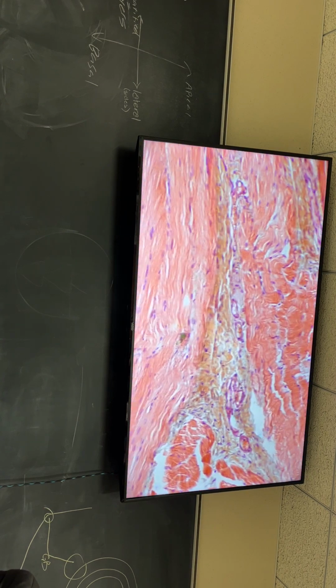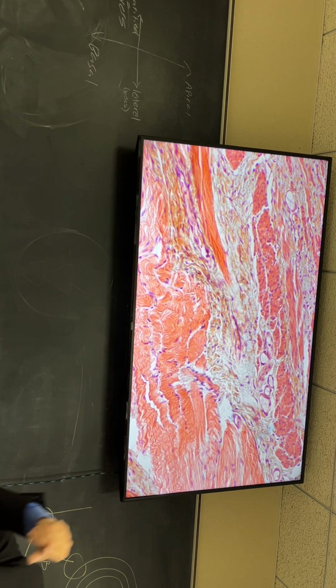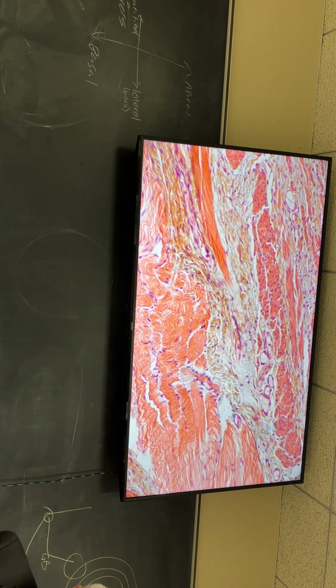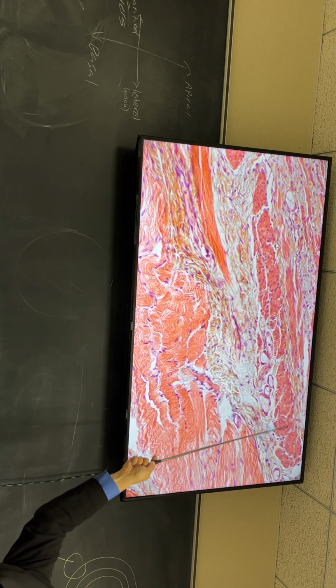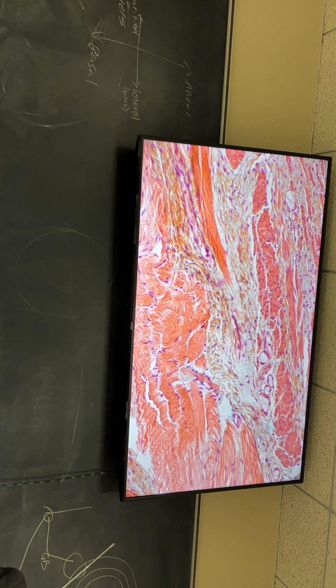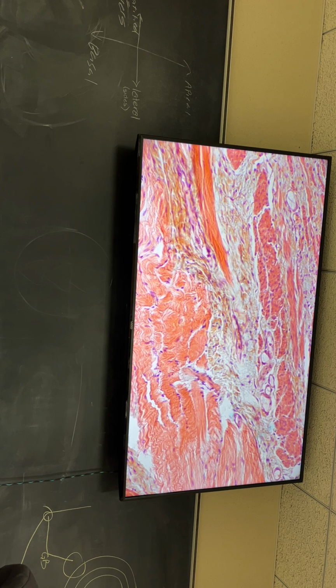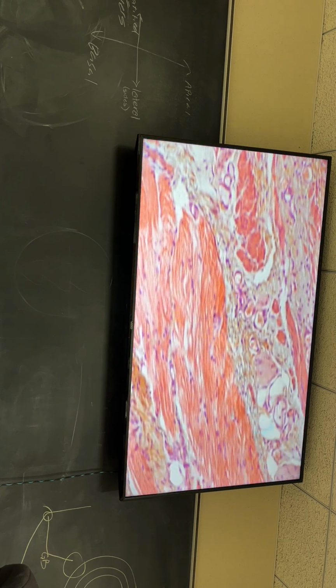Okay. What about this? What's that thing there? Muscle. Skeletal. What is that? Cross-cut smooth muscle. Is it smooth muscle? No, that's skeletal muscle. Going more in one direction, right? Okay. What else? Anything else? What's in the areolar tissue? Nothing else? There's nothing else in there.